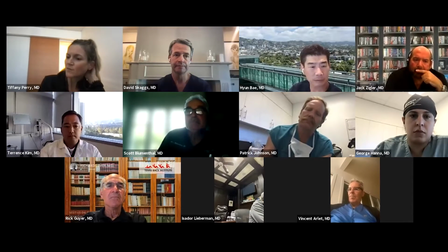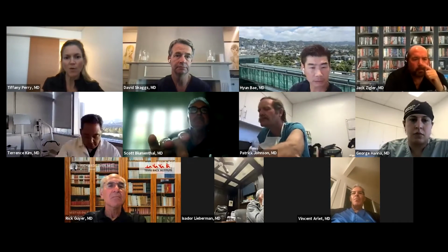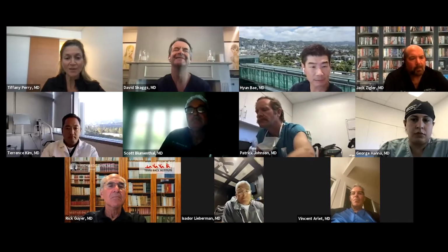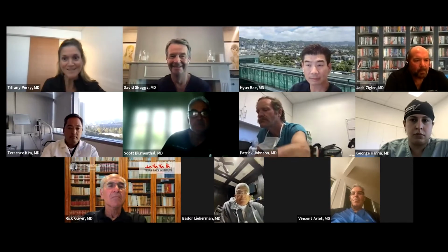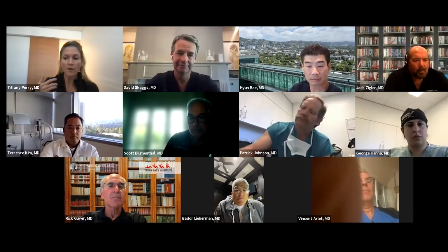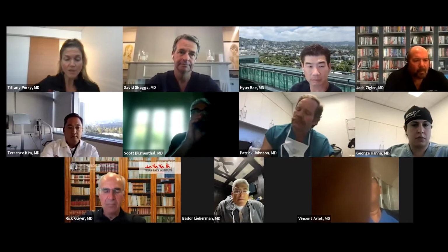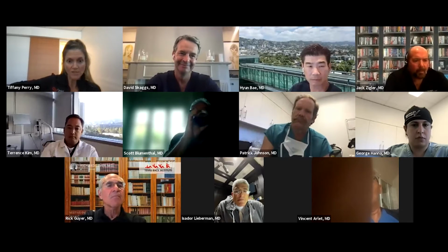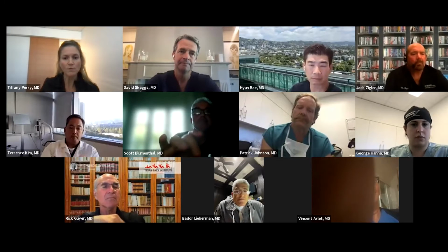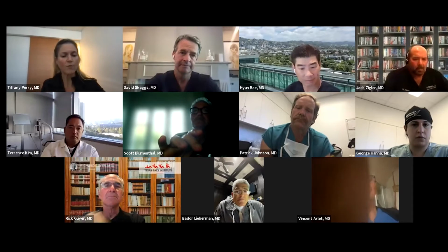And one thing, Dr. Skaggs, that I think you brought up before with me was I explained to you that some of the power tools I've tried using here, our tools are very long. And you need to incorporate this into your talk as well. You have special made tools that are shorter in length, where I think ergonomically as a surgeon, if I have to get on 3 steps to use power tools and my patient's far down, then I actually have cervical flexion, which is also really bad for my cervical spine. And so you have special made shorter tools, which are ergonomically much, much more favorable for you.